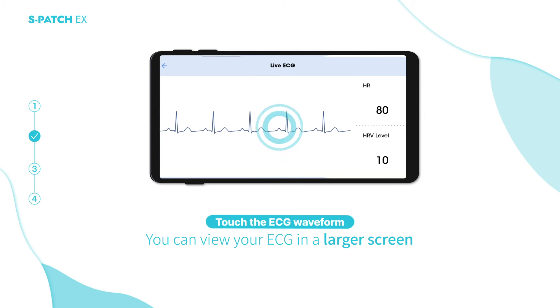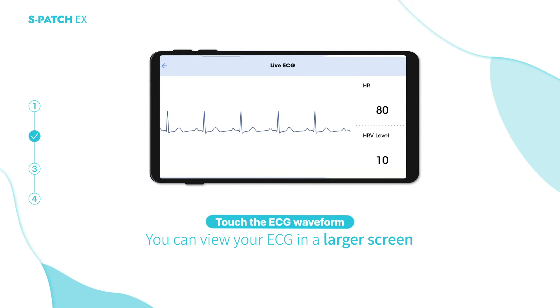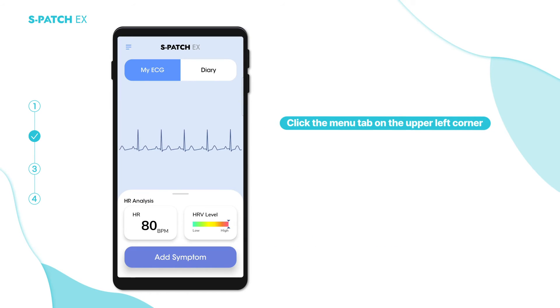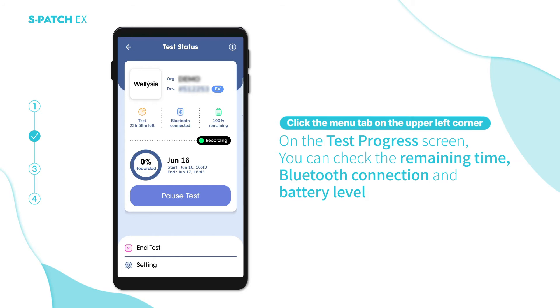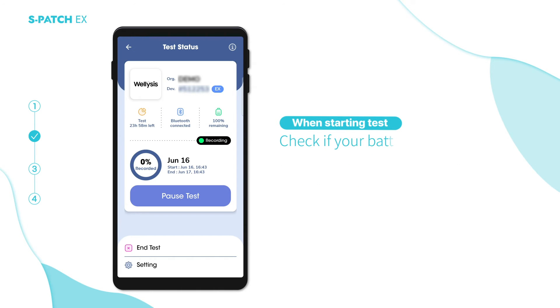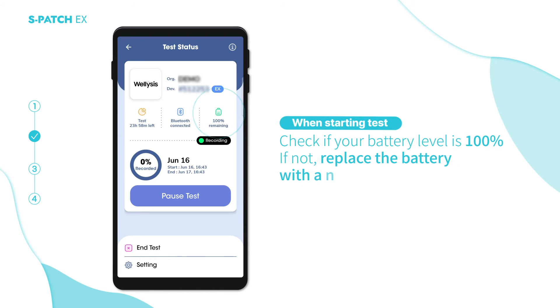If you touch the waveform, you can view it in a larger screen. Click the menu tab on the upper left corner on the test progress screen to check the remaining time, Bluetooth connection, and battery level. When starting a test, check if your battery level is 100%. If not, replace the battery with a new one before proceeding.